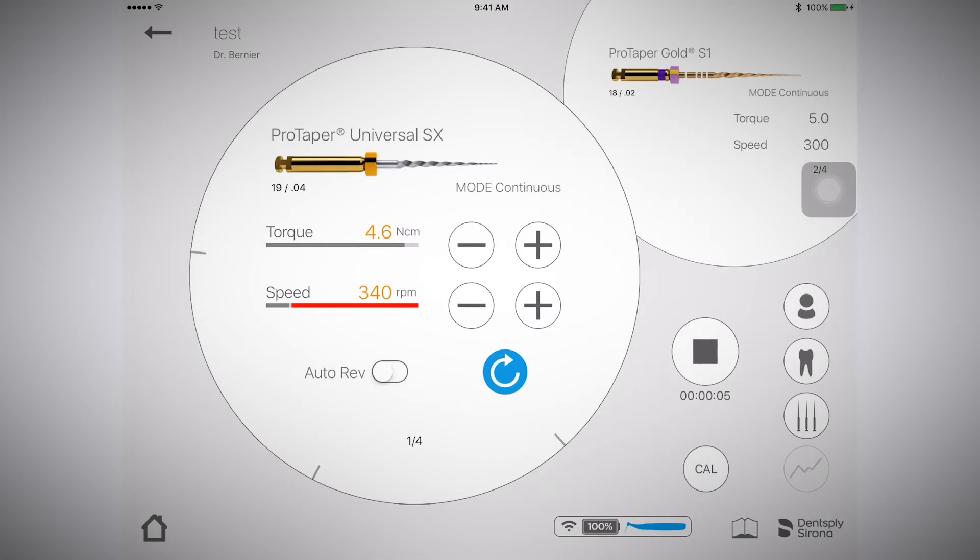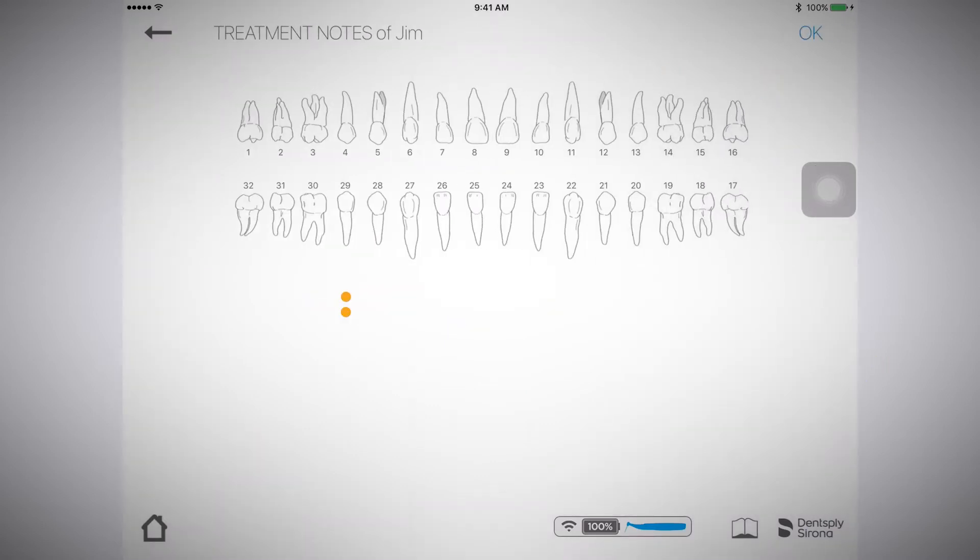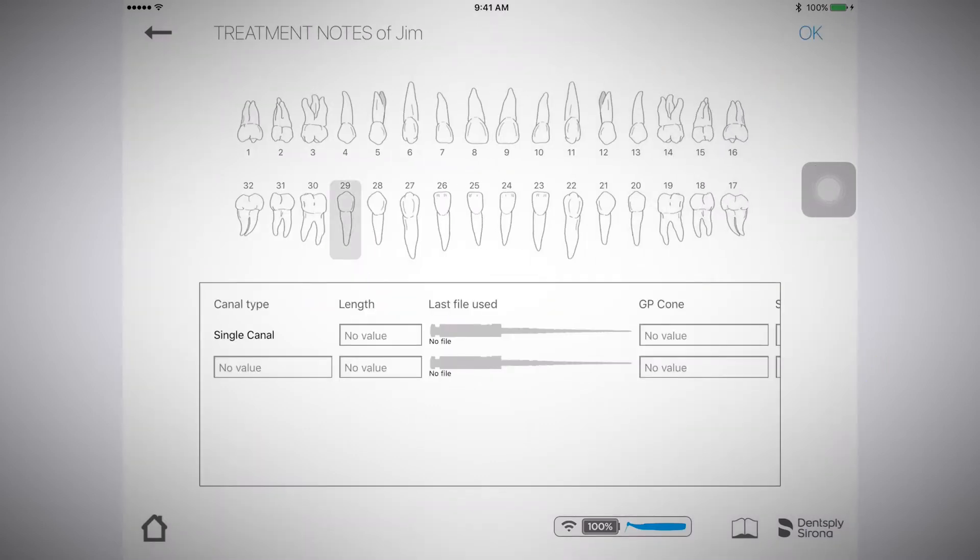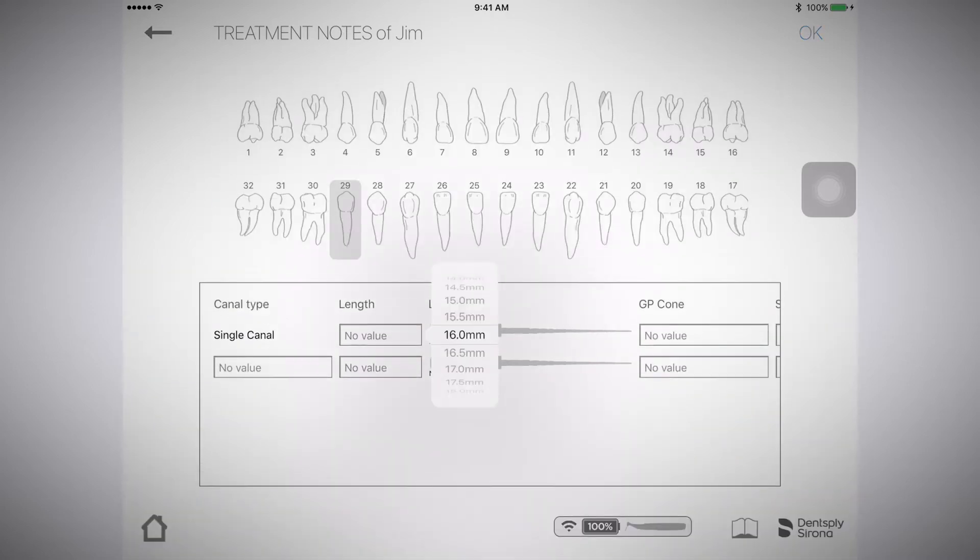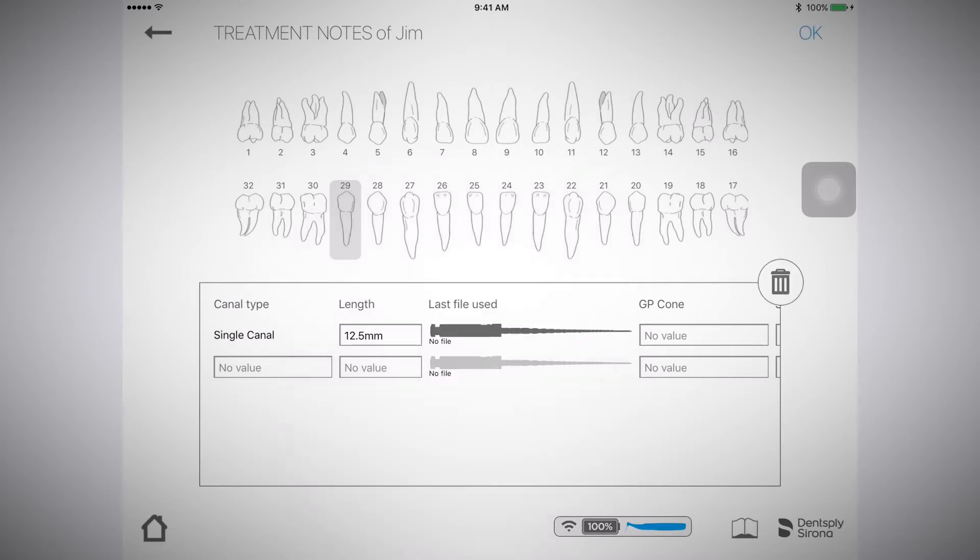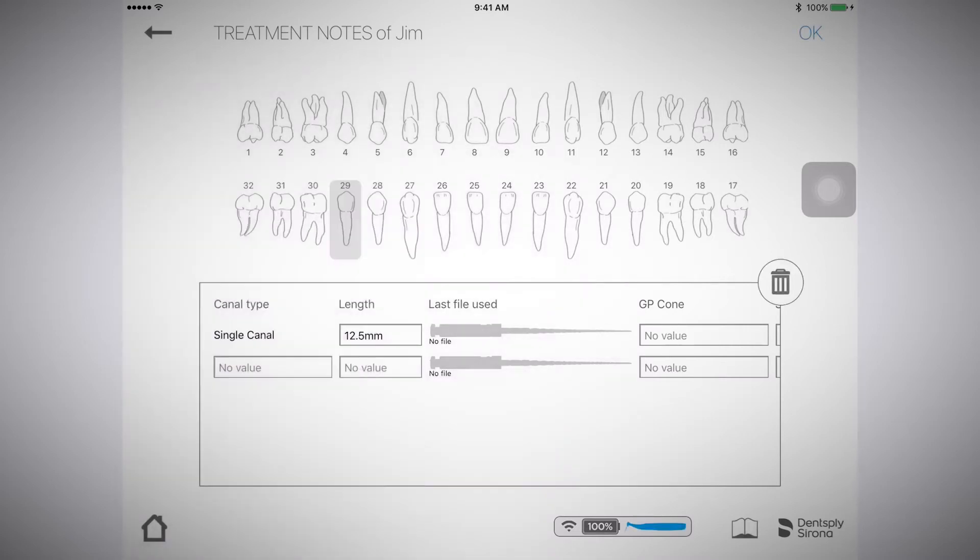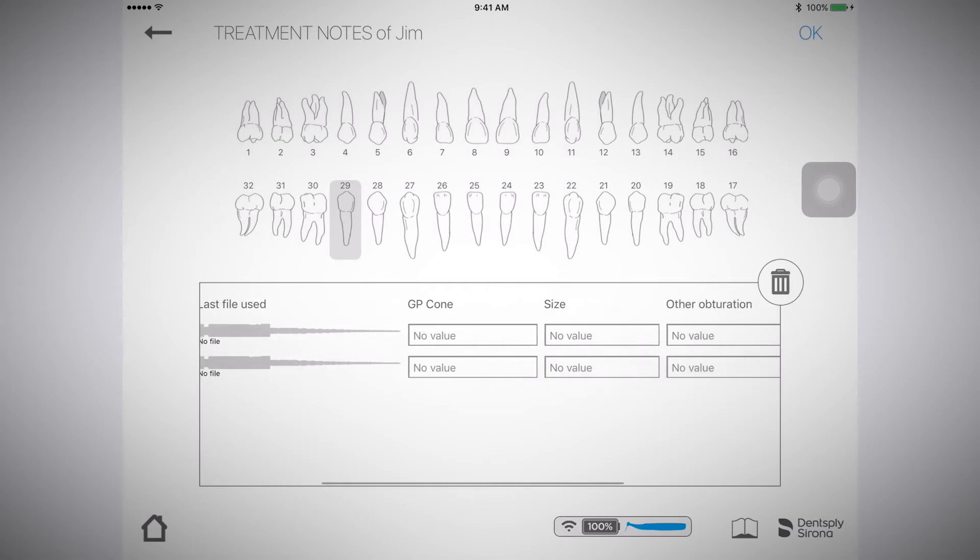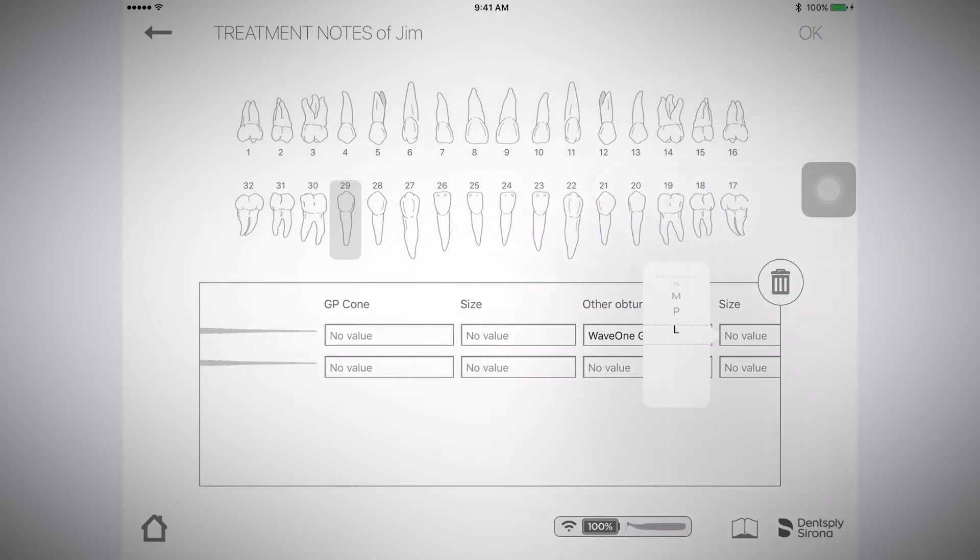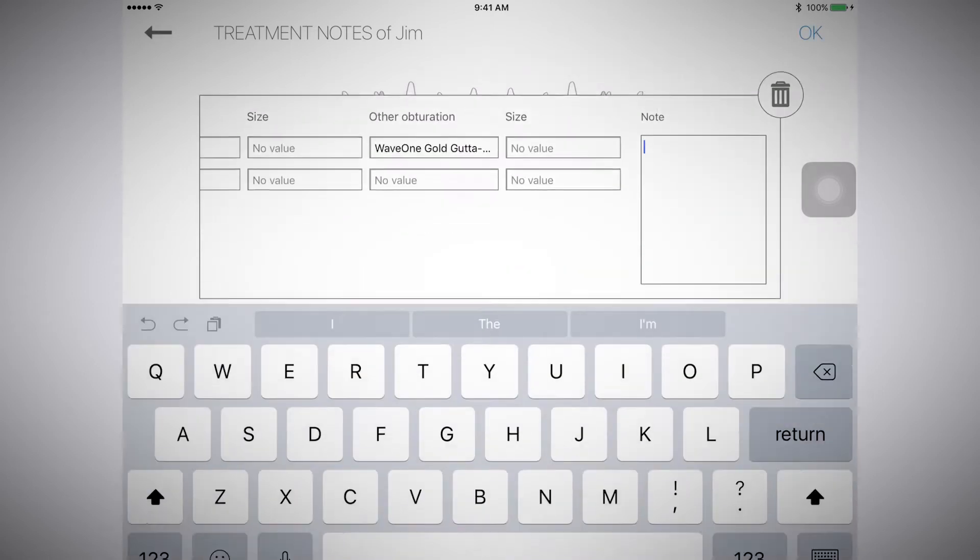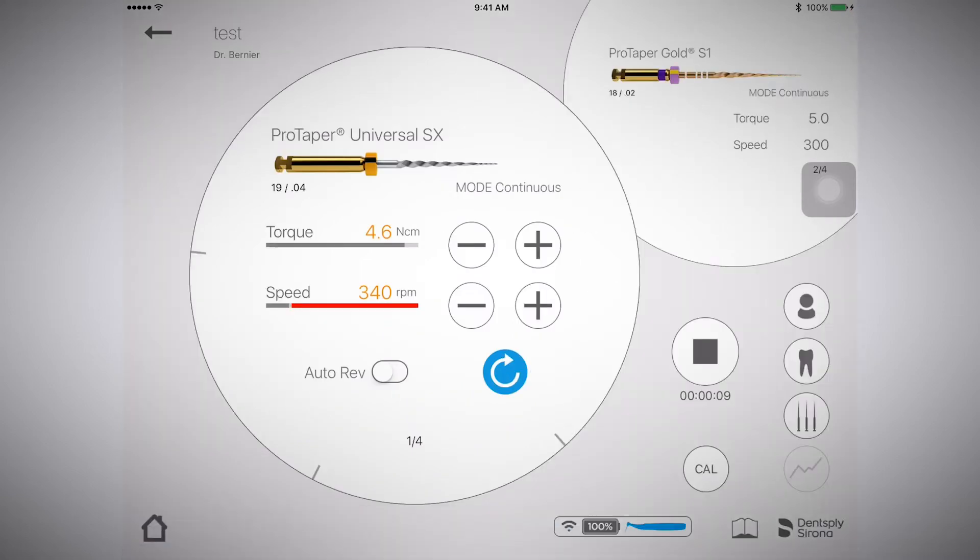Now, select the tooth icon. Select the tooth you will be working on. You can enter the different information that goes along with this now or at the end of the procedure. Select OK.